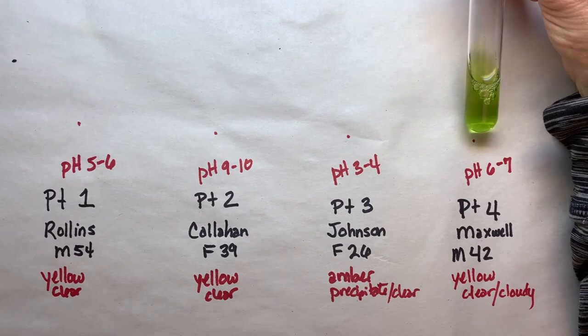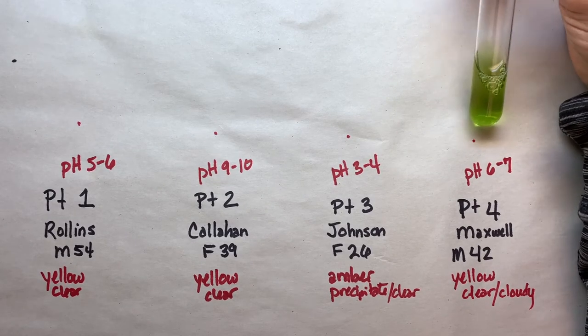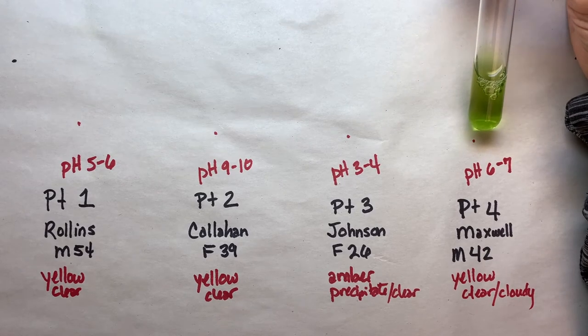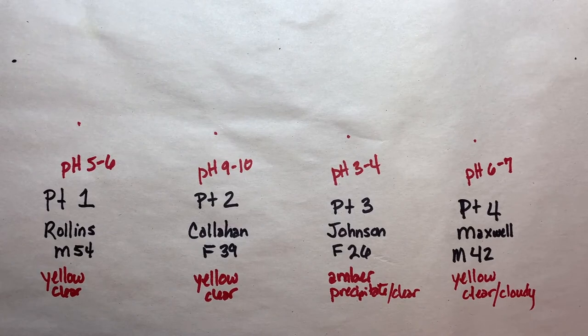And here is green again, Mr. Maxwell down here, a little bit cloudy but still green. So that's a negative for protein for Mr. Maxwell.